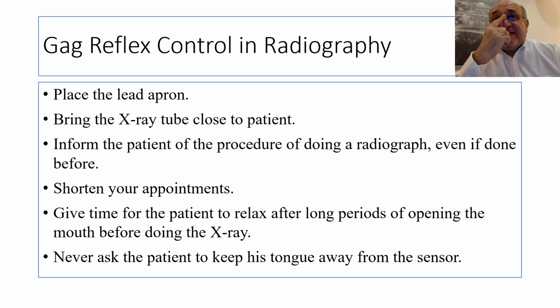Even if your patient has had an X-ray before, inform your patient, whether he is old or a child, about the procedure that you are going to do. Tell him, I'm going to put the sensor inside the mouth. This might cause some discomfort, so please bear with me.